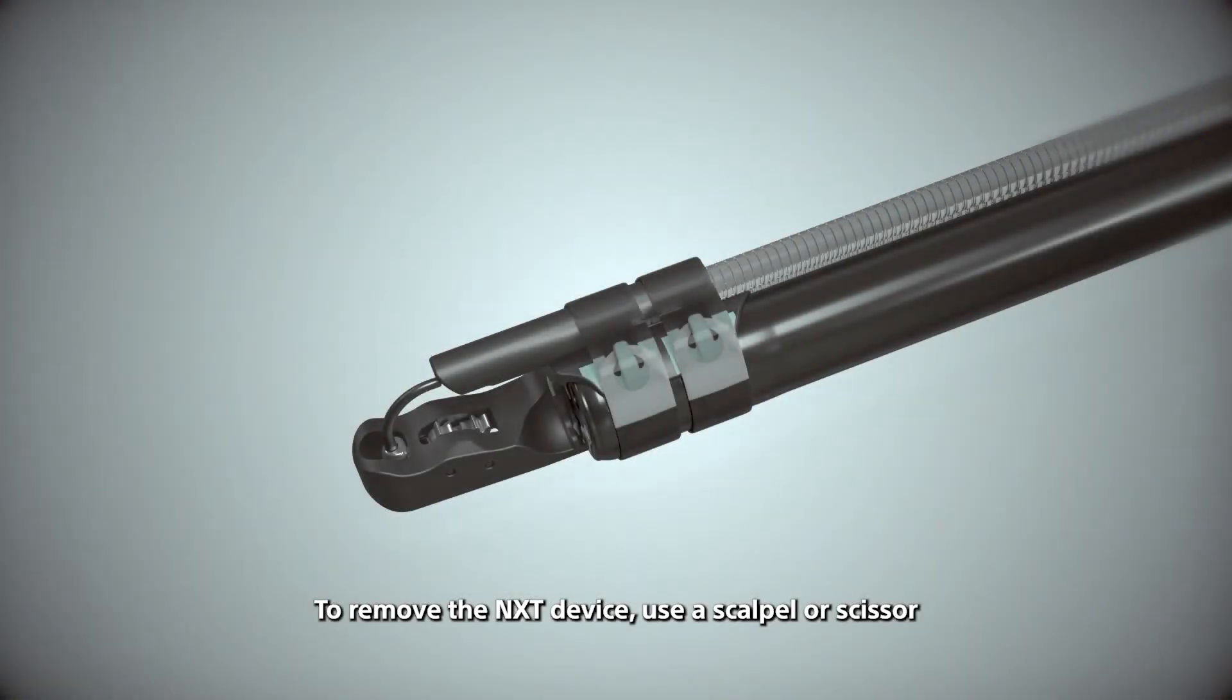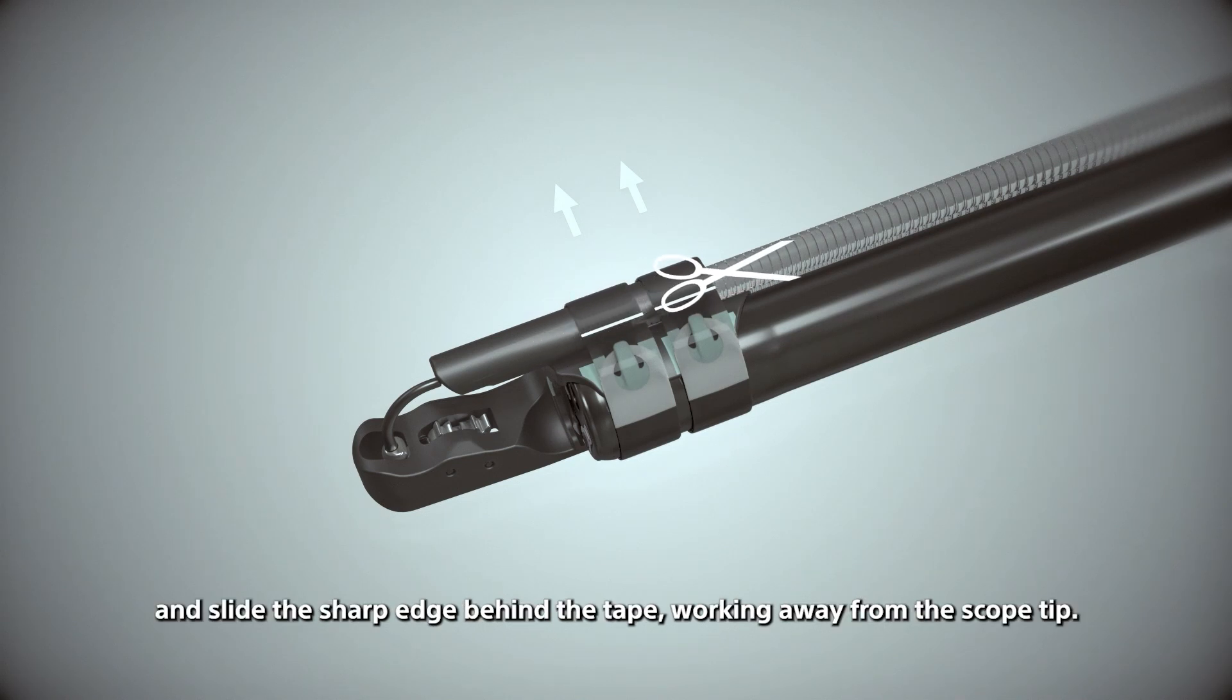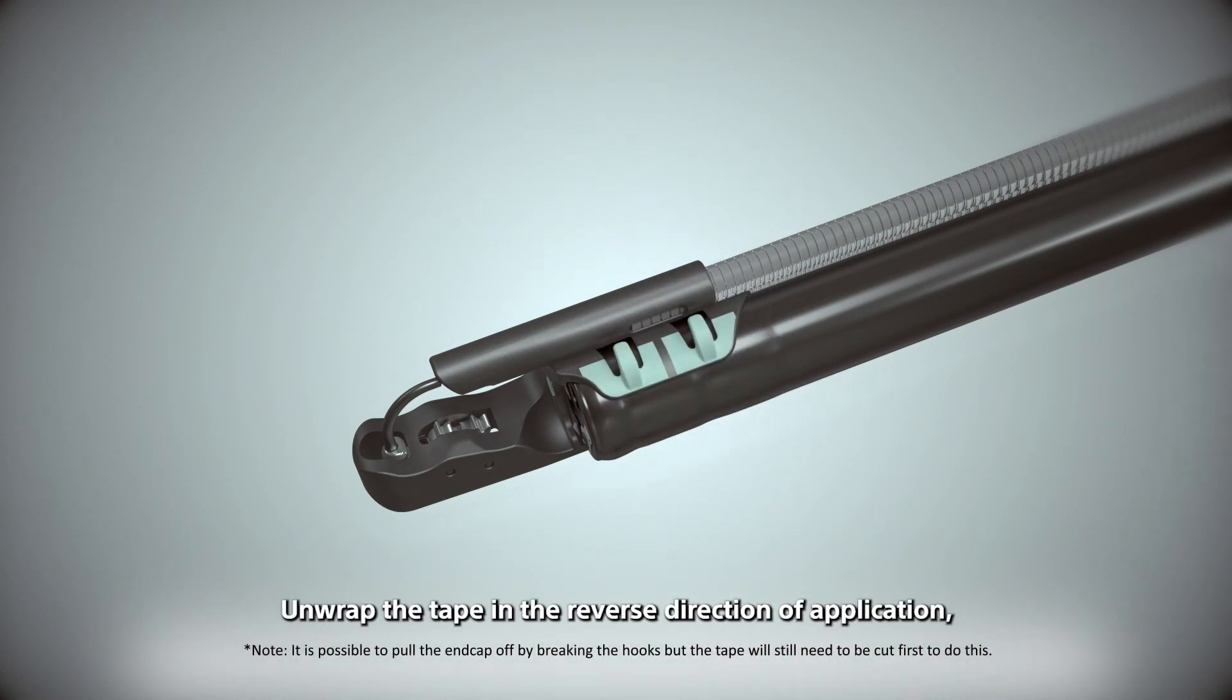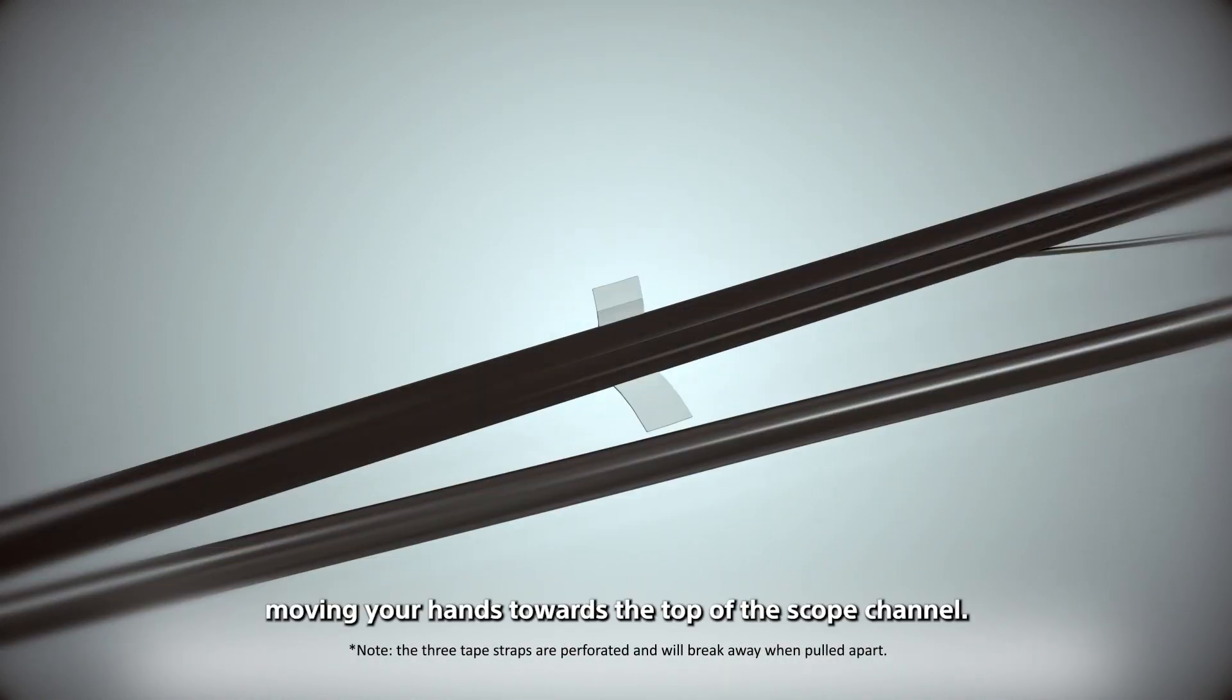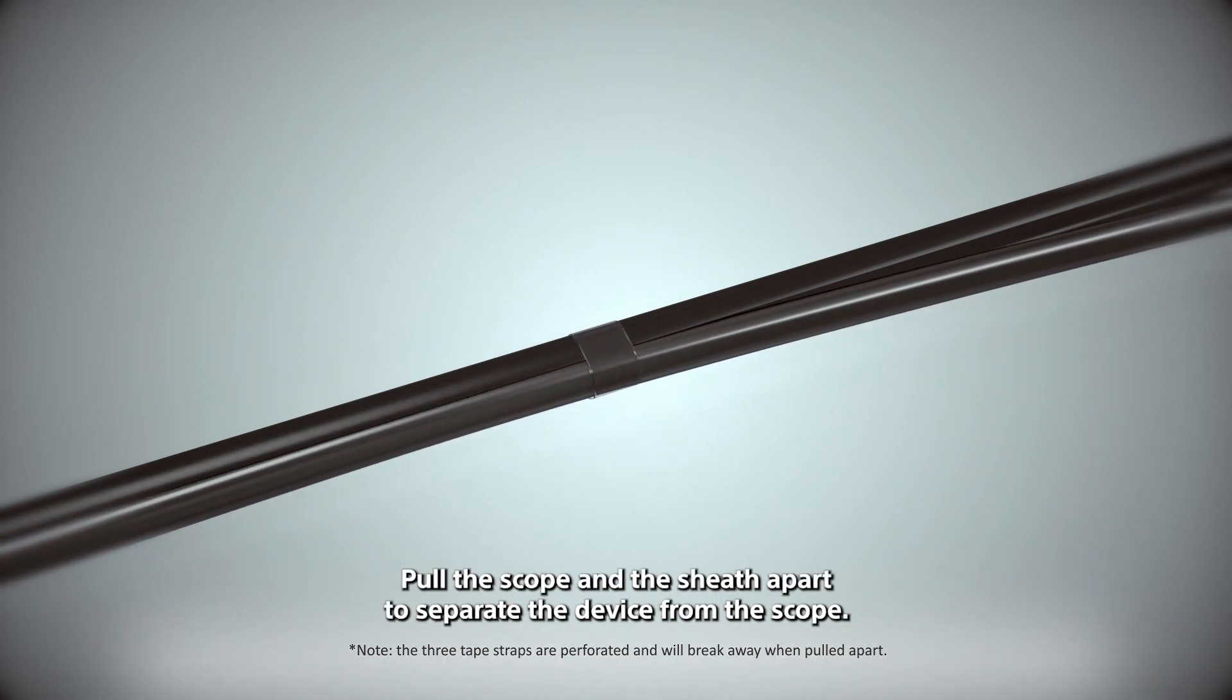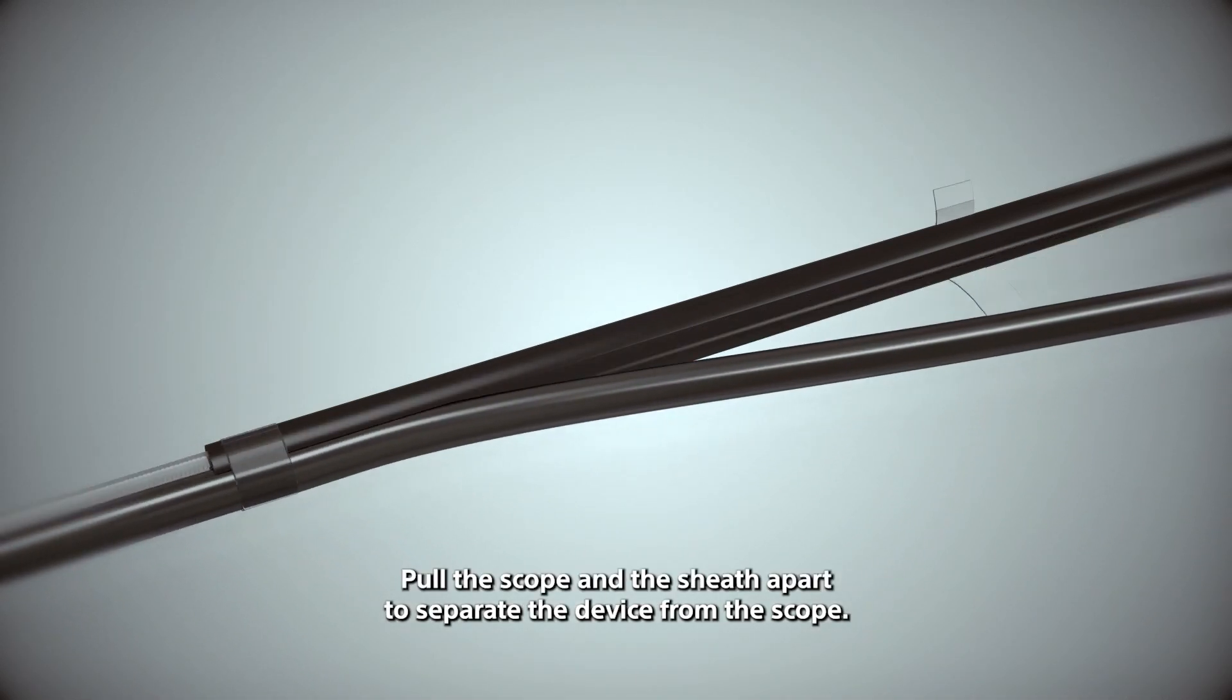To remove the NXT device, use a scalpel or scissor and slide the sharp edge behind the tape, working away from the scope tip. Unwrap the tape in the reverse direction of application, moving your hands towards the top of the scope channel. Pull the scope and the sheath apart to separate the device from the scope.